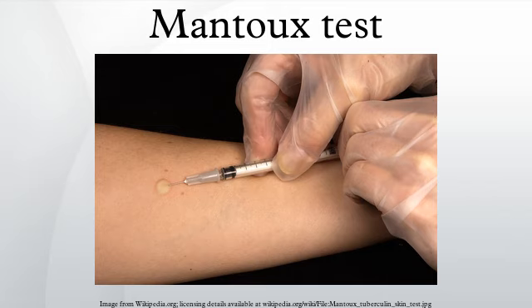Use of two-step testing is recommended for initial skin testing of adults who will be retested periodically. This ensures any future positive tests can be interpreted as being caused by a new infection, rather than simply a reaction to an old infection.